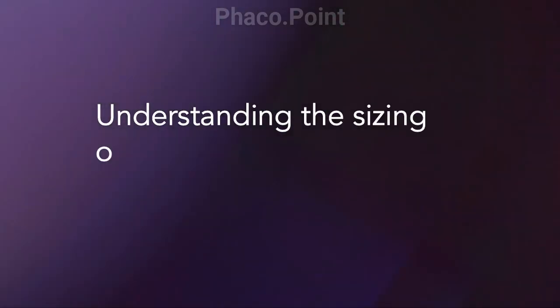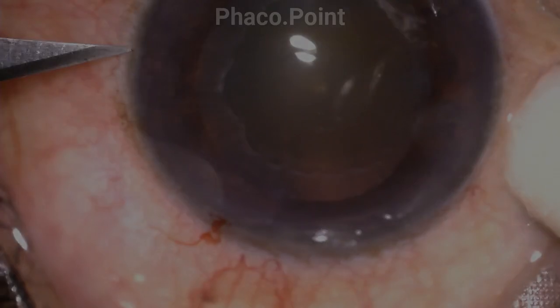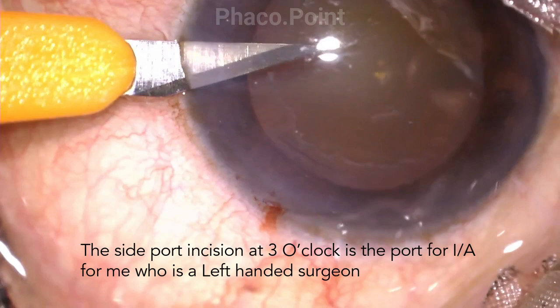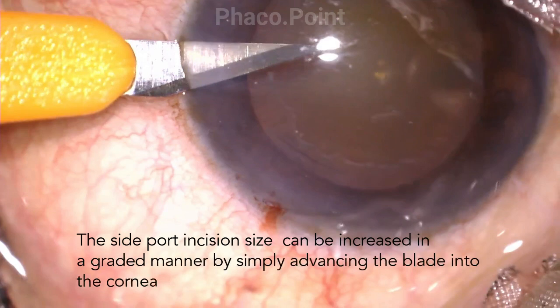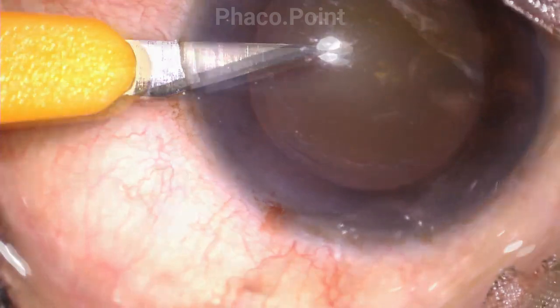Let's now understand the correct sizing of both paracentesis incisions. The incision on the left is the one used for irrigation aspiration alone. This incision has to be at least large enough to allow for the 20 or 21 gauge irrigation aspiration cannula. The way we increase the width of the incision is by progressively increasing the extent to which the lance tip is introduced into the eye, as seen in the image above.